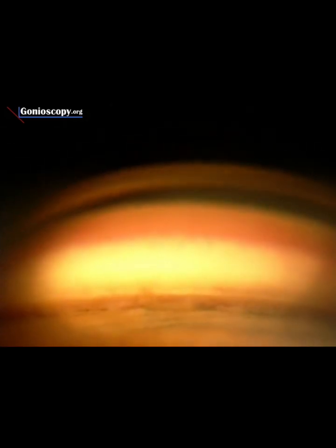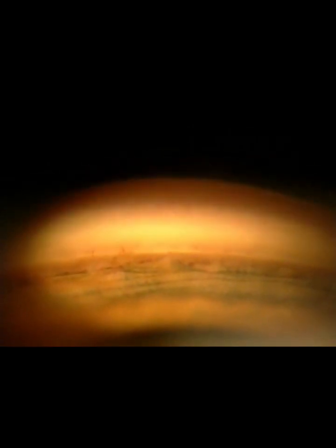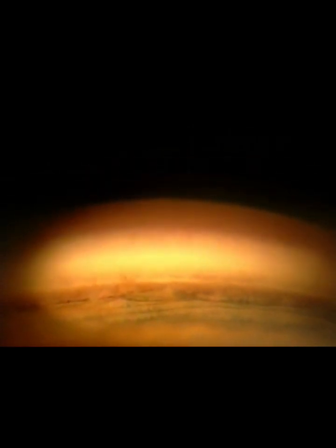In this video, we see the normal angle of a myopic young patient. There's the iris, a moderately wide ciliary body face, scleral spur, a lightly pigmented meshwork, and here's Schwalbe's line. By the Spaeth classification, we would call this a D, because it inserts deep into the ciliary body face, an angle of 40, a flat iris, and 1+ pigmentation.